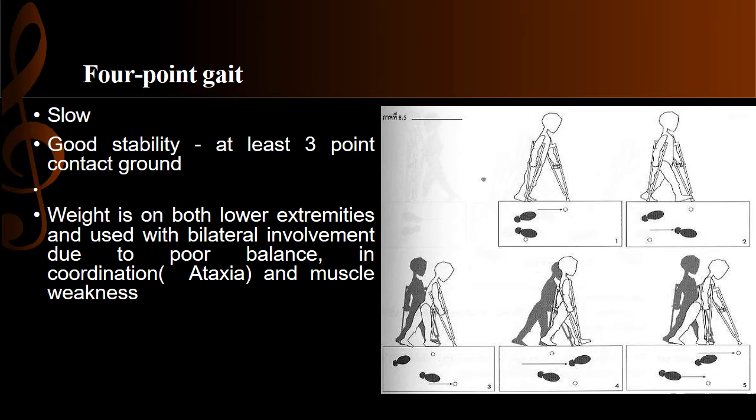In the four-point gait, each point — crutch and limb — moves separately. The pattern is: left crutch forward, then right foot forward, then right crutch forward, then left foot forward. The movement is opposite but always separate. This gait pattern is slow and provides lateral stability. It is most commonly used for patients with balance and coordination issues or muscle weakness.